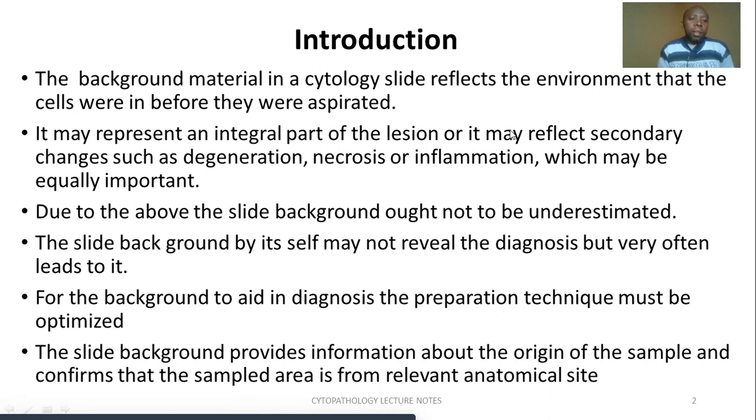And these are all equally important, and they should be taken care of because they always guide us on how to make conclusions in regards to our evaluation of the slides. Due to the above, the slide background ought not to be underestimated because it will guide us in a number of things.